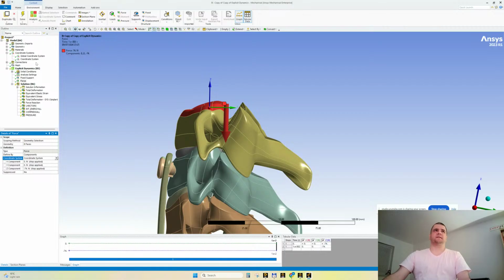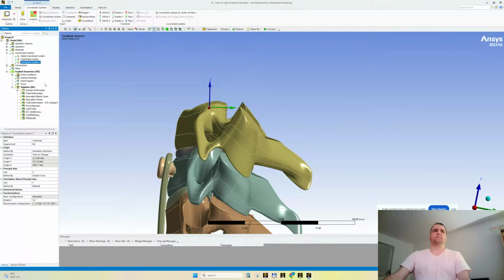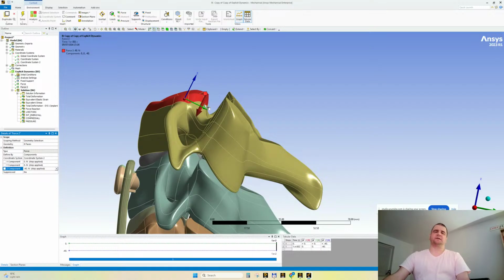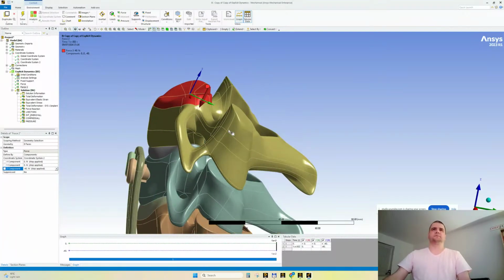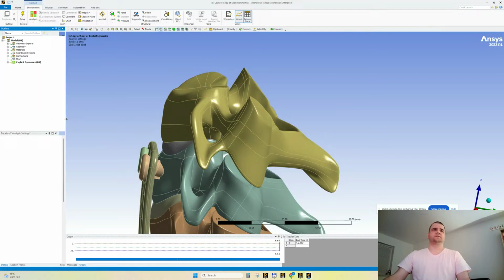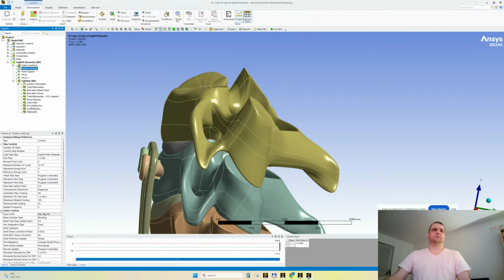Why? Because I would like to have the slanted thing. Let's duplicate this and let's do something like -10. Look here. Yeah, it's slanted now. Let's do -15, why not? Yeah, let's duplicate this, select the second coordinate system, and I promise to have -40. And somehow we filled the absence of the moment. We replaced it as the AI advised, which is a good advice, I would say. So we kept the suggestions from live stream 12.